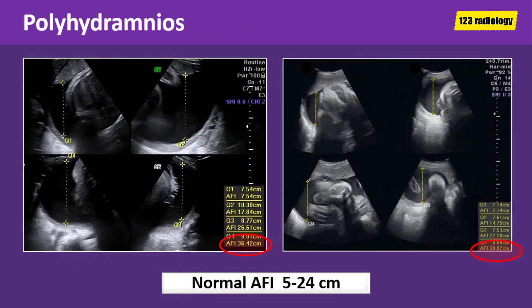These are two cases of polyhydramnios. On the case on the right side of the screen, the amniotic fluid index is 36.4 centimeters. On the other case, the amniotic fluid index is about 30.9 centimeters. The normal amniotic fluid index is between 5 to 24 centimeters.